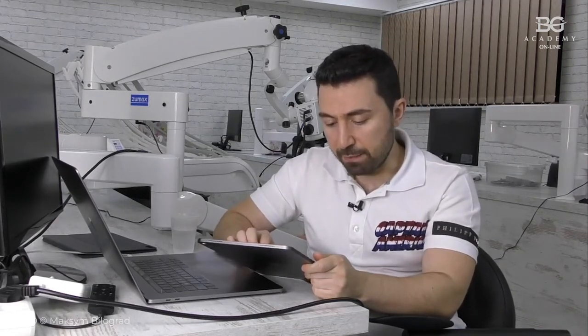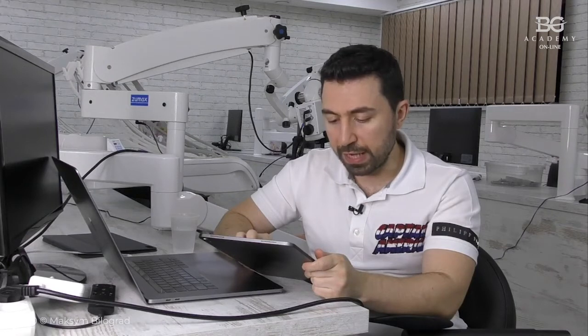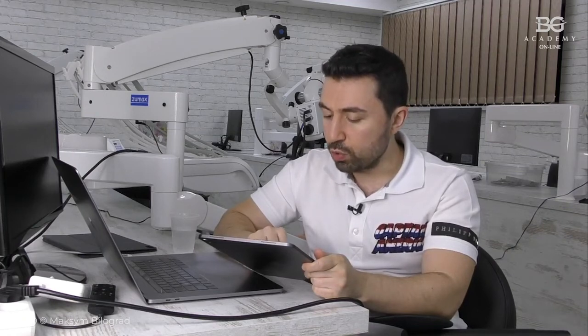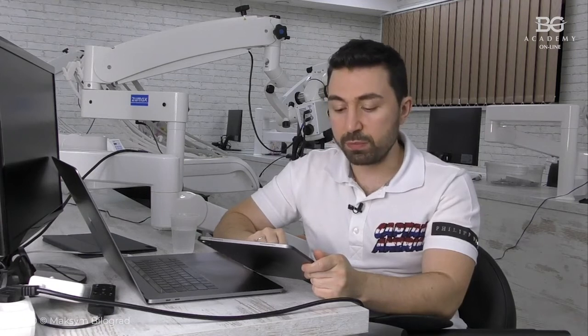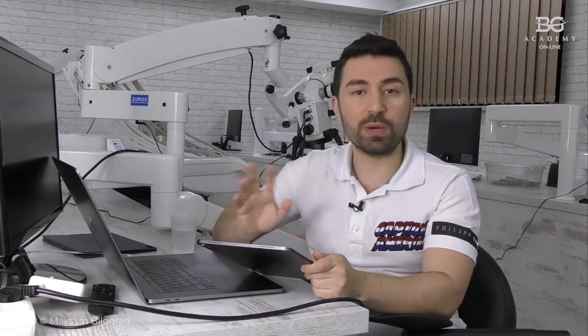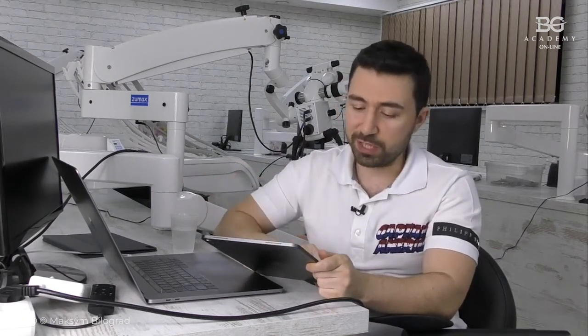Okay, Islam has this question. What if I get a space, like what happened with the veneers in this video? How do I make sure that no space will be there between veneers after cementation? First of all, we used a Phantom, and teeth in a Phantom are not stable. This is the problem. When you put a wedge, they sometimes will not go back. In patient cases, everything should be all right.